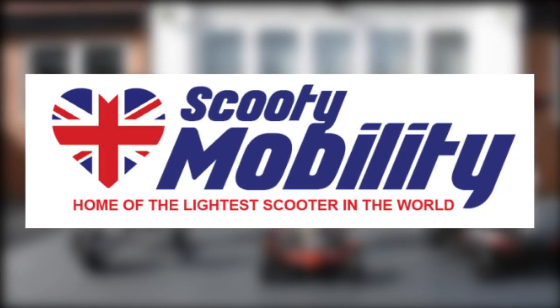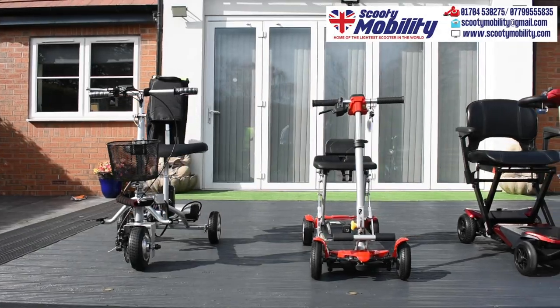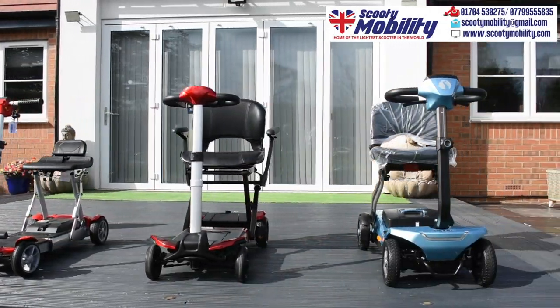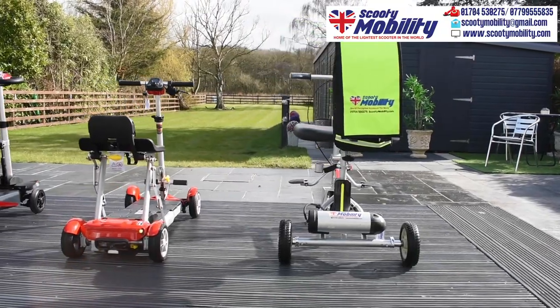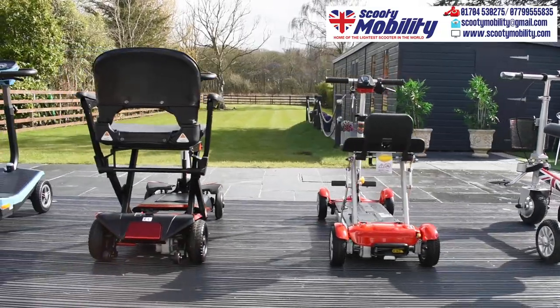Hello and welcome to Scooty Mobility's review of the best and the lightest folding mobility scooters in the world. Here is the display of the folding mobility scooters, and I'm going to talk you through each one individually.